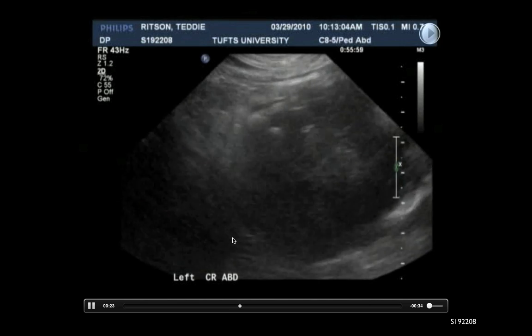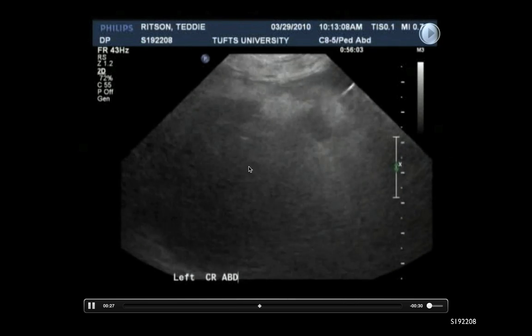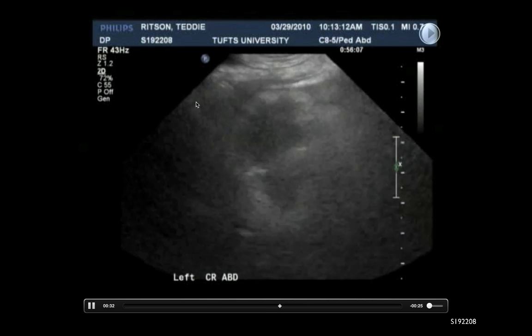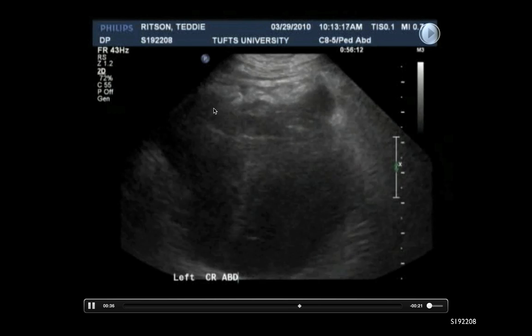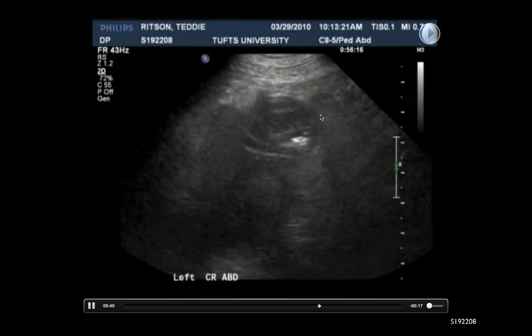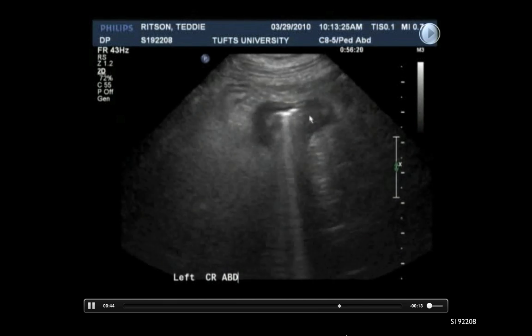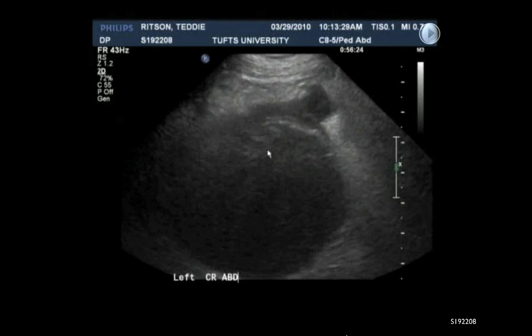In this case, after quite a bit of time exploring the lesion, we can see in the periphery of the mass a structure that we will follow, because it seems that we have sometimes dots of gas in it. And now we recognize that this bowel segment is actually intestinal and seems to be the origin of this mass.